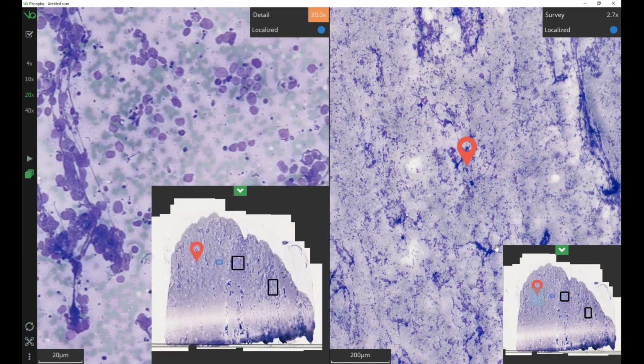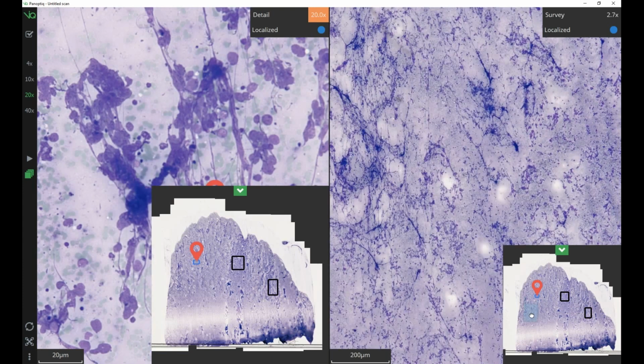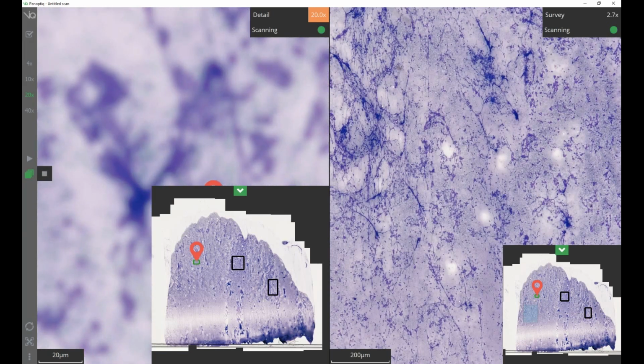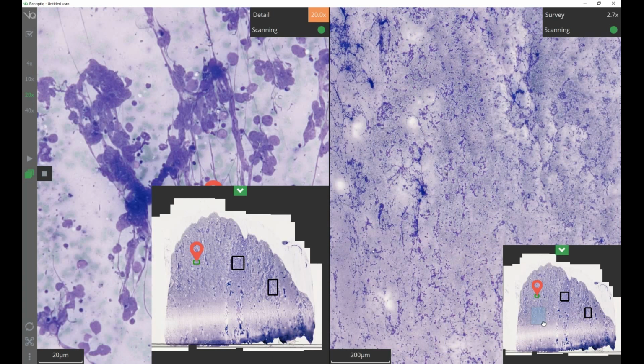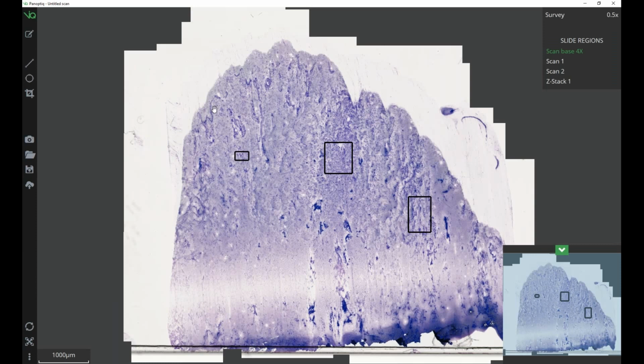And so as I'm continually panning around to view other areas, the technologist continues to scan at higher magnifications or use other Z-stacks. And for the purposes of this demonstration, I can go into the review mode, although this could happen in a live field on that same screen.